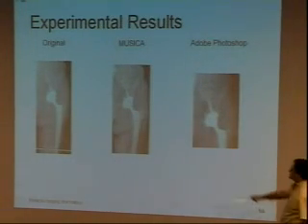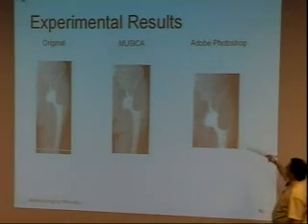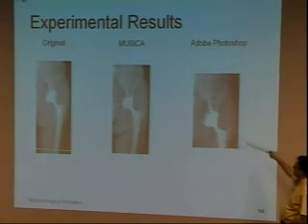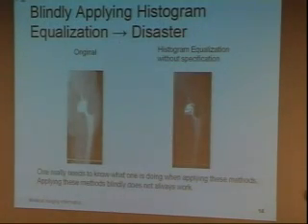Now, here is the original again. Here is MUSICA's version. And actually, just for some fun, I tried to see whether I could get something out of Adobe Photoshop. And it's not bad, to see what it could do to get this bone structure out. Actually, it looks better on my screen than it did when it was reproduced on my PowerPoint slide. However, the real take-home message is here.